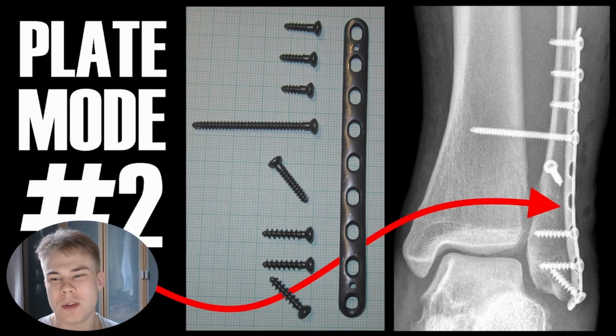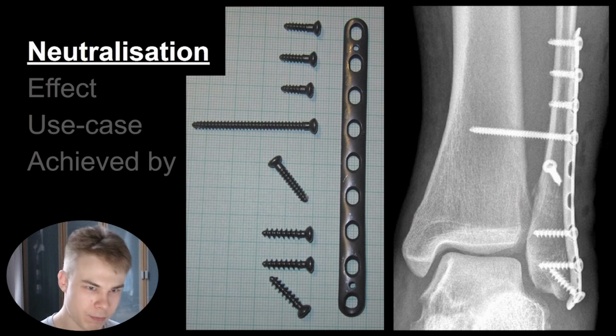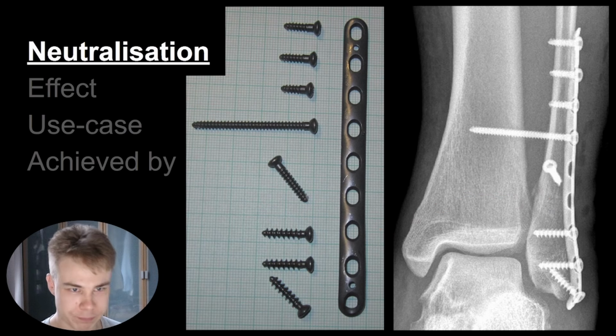Then we can talk about plate mode number 2, which was in the thumbnail. And guys, I always deliver on my thumbnails. I never leave you hanging with it. If it's in the thumbnail, it's in the video. And that is a neutralization plate.